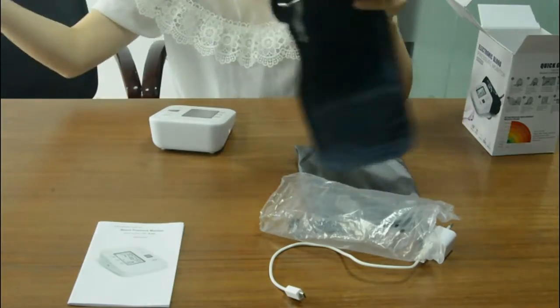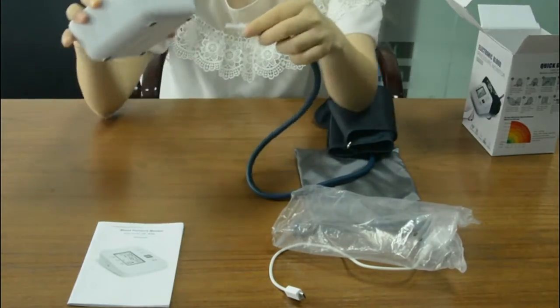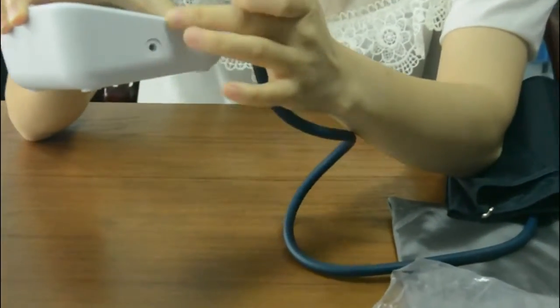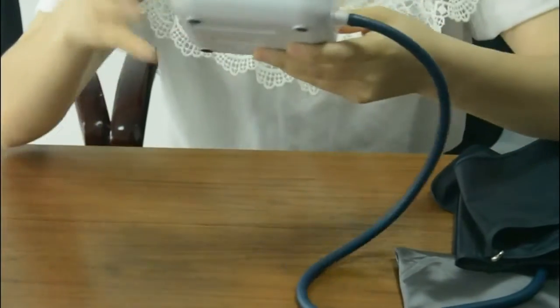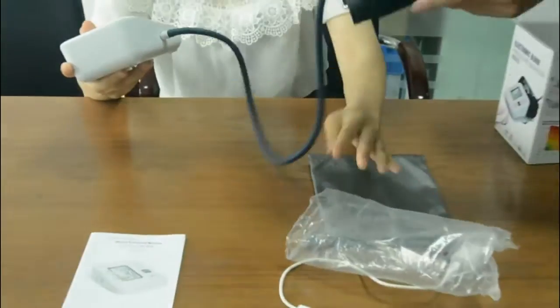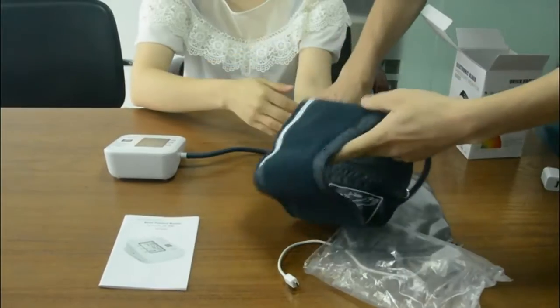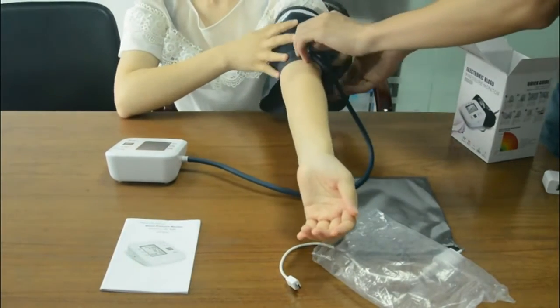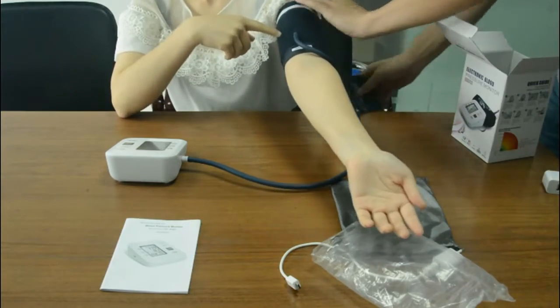Now I want to open the arm belt. What you need to do is connect the tube with the slot. You need to pull the tube with your hand like this, then wear the belt on your arm.